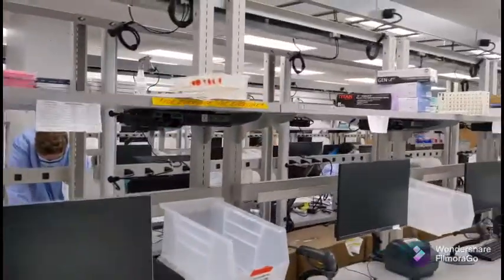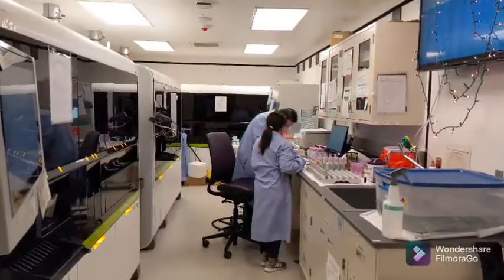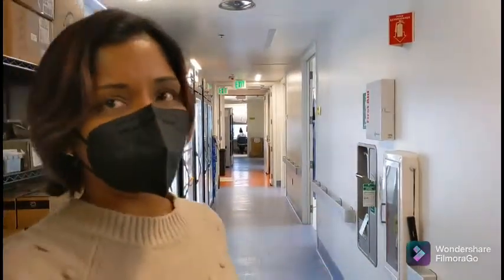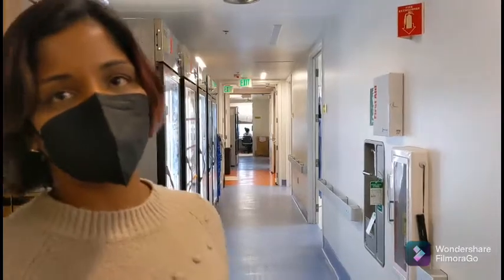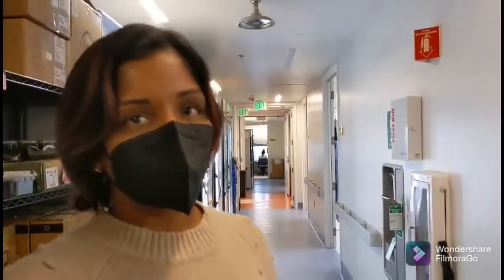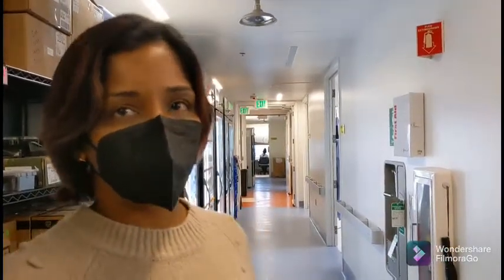And this is the team hard at work processing these tests. These are some examples of the platforms we have that can go from sample to test result, and they allow us to also process these large batches of samples at a time rather than doing them one by one. And this is the room where we say positive or negative on the samples, right? One of the many systems on which we are able to say positive or negative, yes.